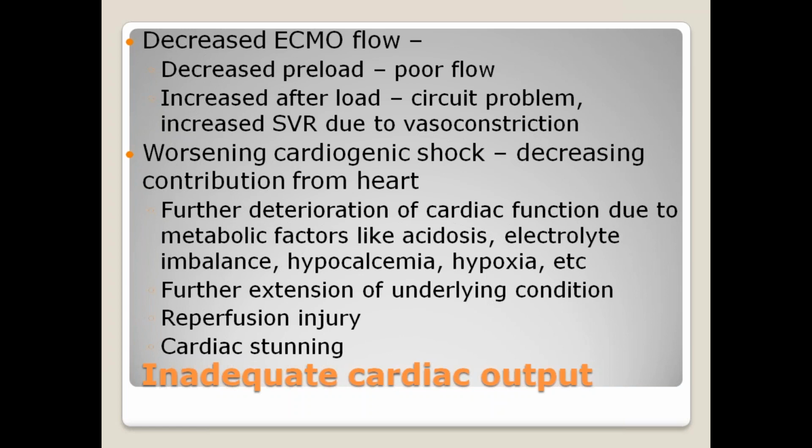Okay. See, pulsatility is important. I don't say no. But the study says that if the pulsatility is not there, if you maintain good flow, then there is not much difference between non-pulsatile flow and a pulsatile flow. The issue comes only when you have a non-pulsatile flow and your cardiac output is low. If you can maintain pulsatile flow, well and good. But if you cannot maintain pulsatile flow and your tissue perfusion is still not adequate, then don't bother about the pulsatility. Pulsatility will come back. Keep on going high on the flow.